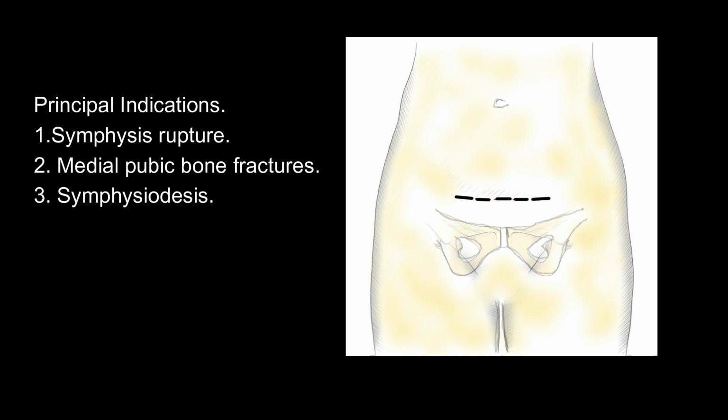Principal indications. 1. Symphysis rupture. 2. Medial pubic bone fractures. 3. Symphysiodesis. Positioning and incision.